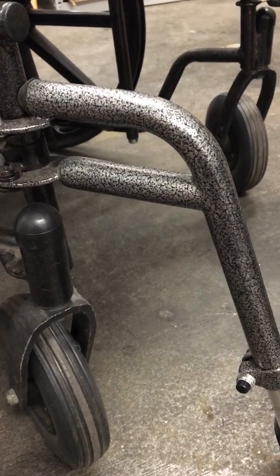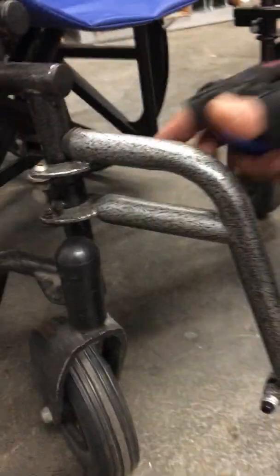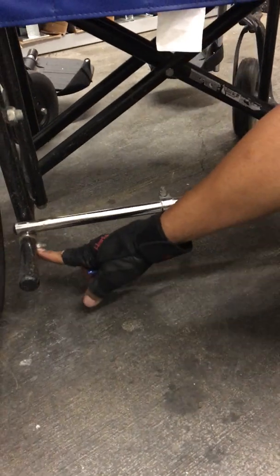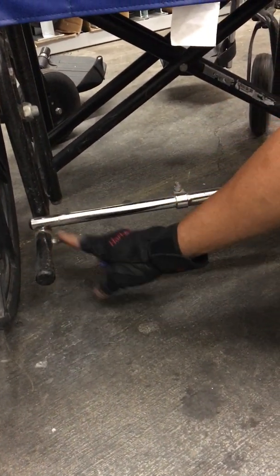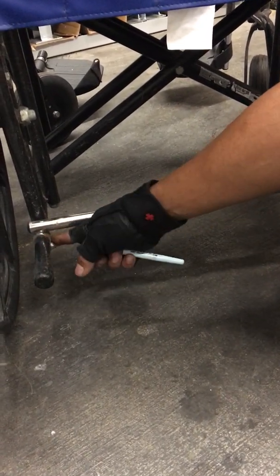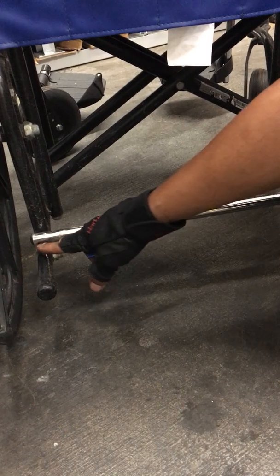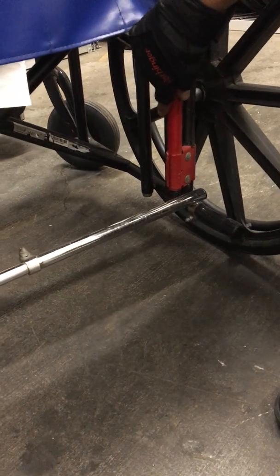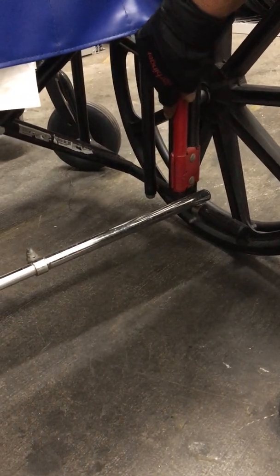So next is the anti-fold bar, which is right here. Anti-fold bar can be very tricky because it doesn't perfectly go to this size of this diameter, so you have to kind of adjust into it and bend it, use a hammer and things like that. So this would take about 20 to 30 minutes.